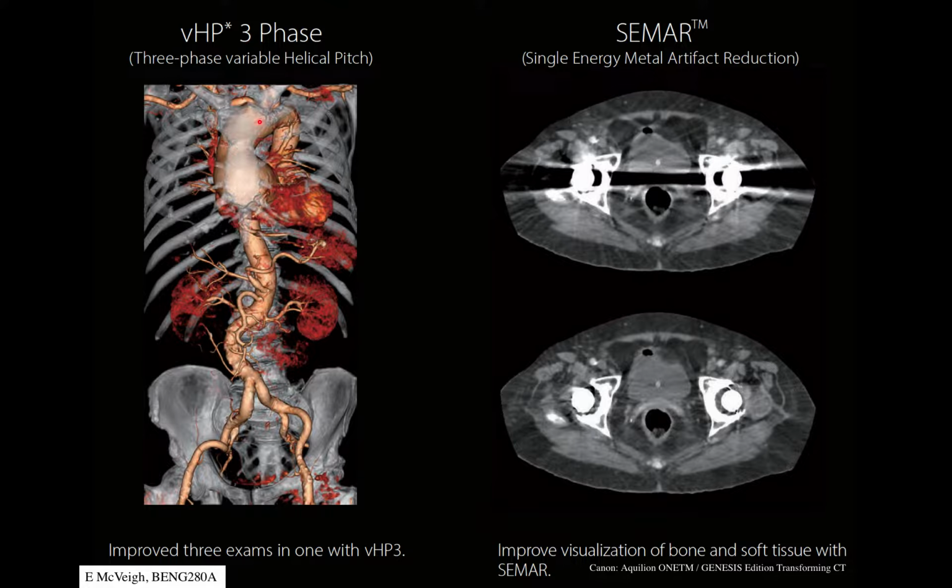The aorta here has a distension, and it's being highlighted by a contrast agent again, which is in the blood. Now, this patient was essentially pushed through the CT scanner at about a meter per second or something like that as they're being scanned, and the whole thing's done very rapidly.